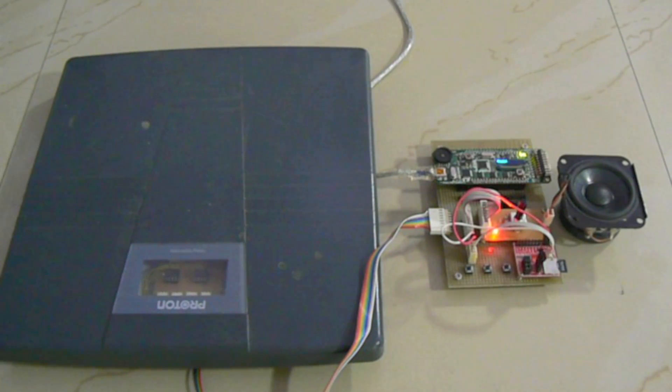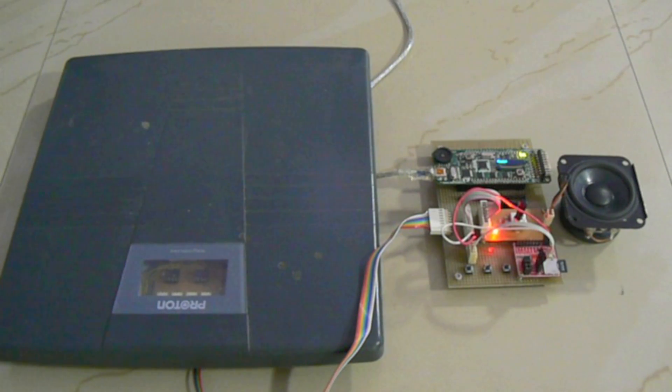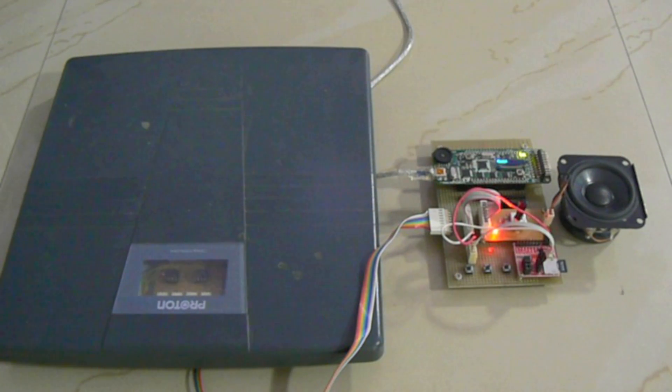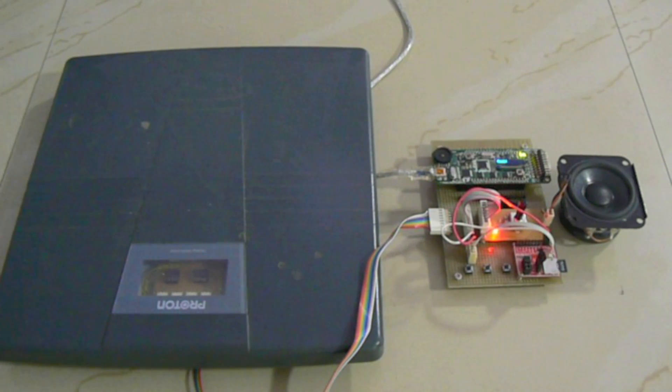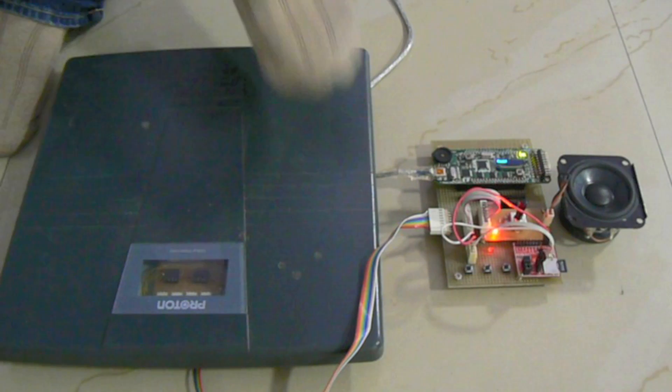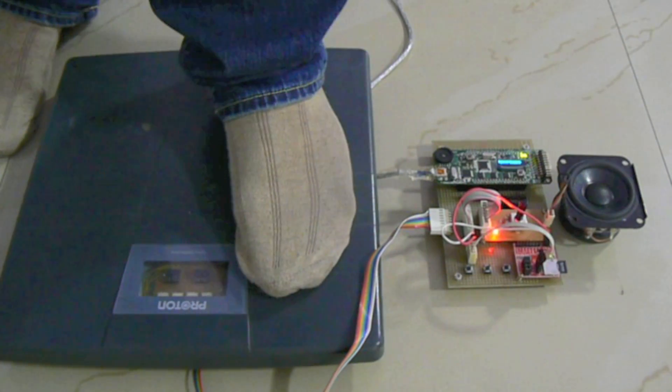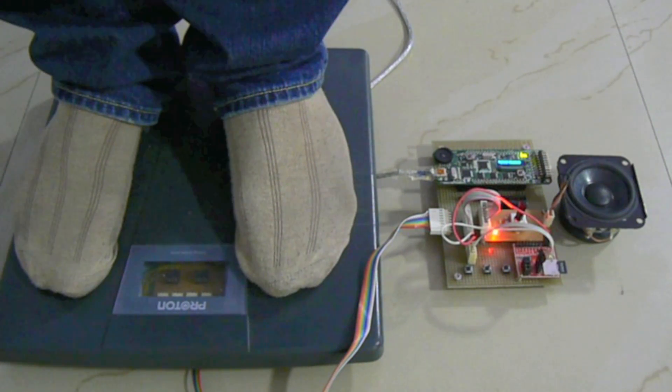Now we will show you a demo of the working prototype. With the weighing scale bus connected, when the device is powered on, the language selected by default is English. The user then stands on the weighing scale to take his weight reading. After a couple of moments, the reading is sensed by the microcontroller unit and sent to the audio circuitry for readout.